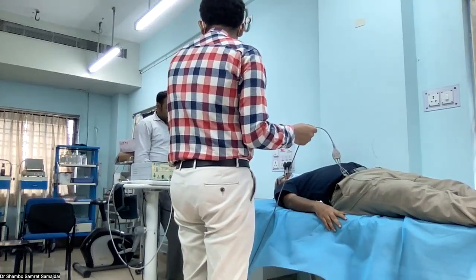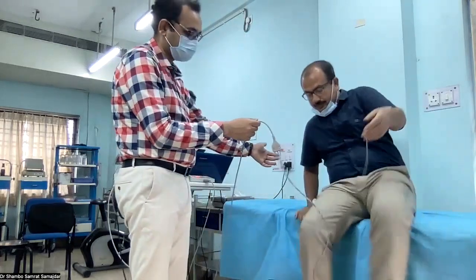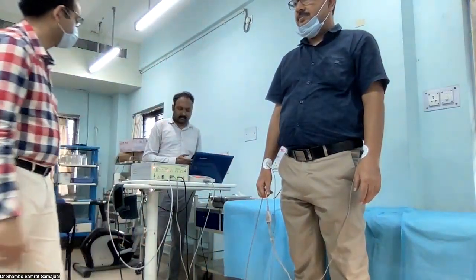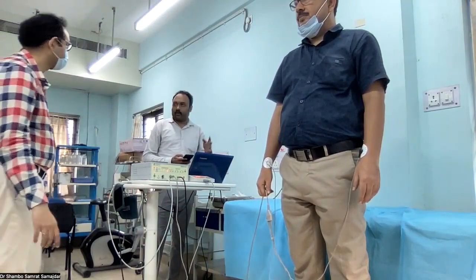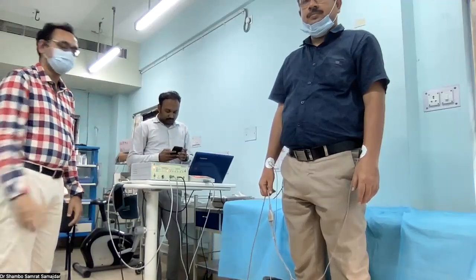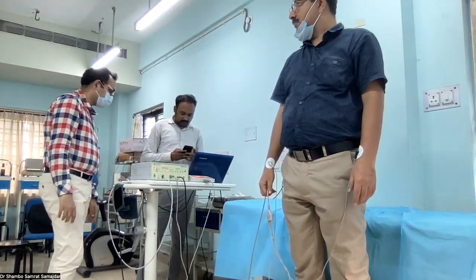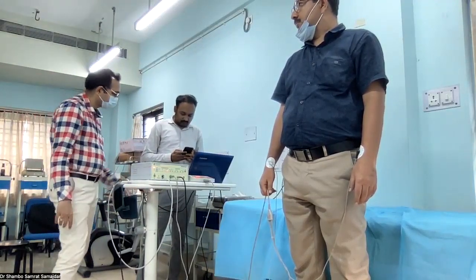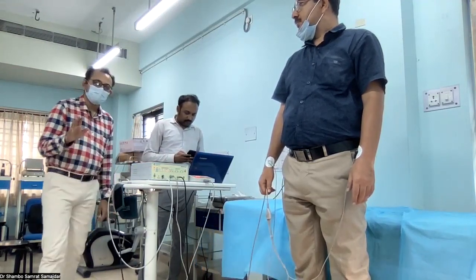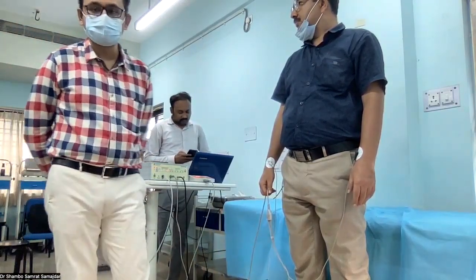Okay, are you ready? Ready? Then please stand. Yeah. So recording ECG when the patient is standing. So in the standing position, we need to record the ECG. So this will be again for total 60 seconds. So we need to ask the patient to stand up for 60 seconds.